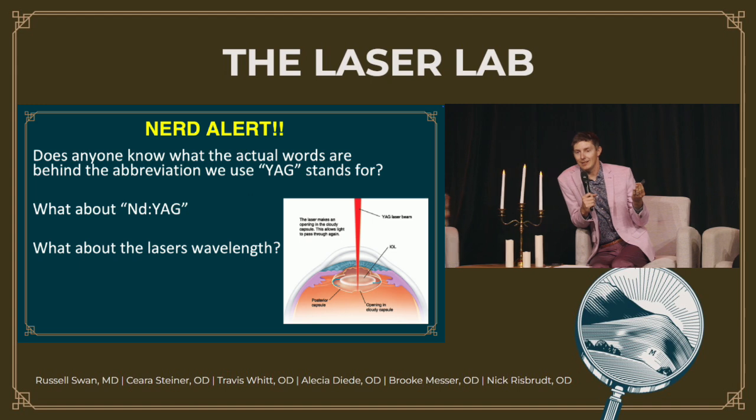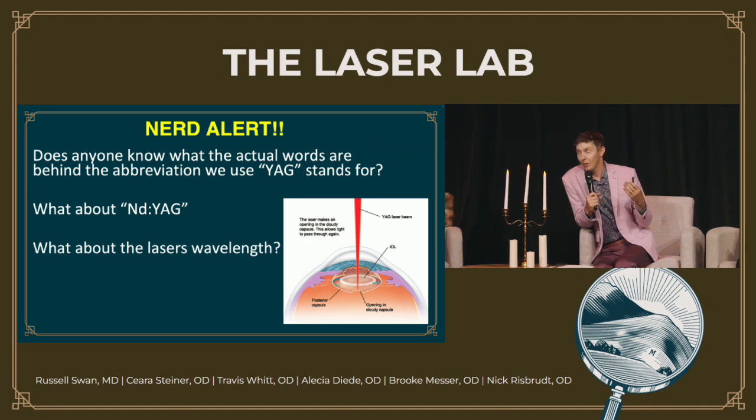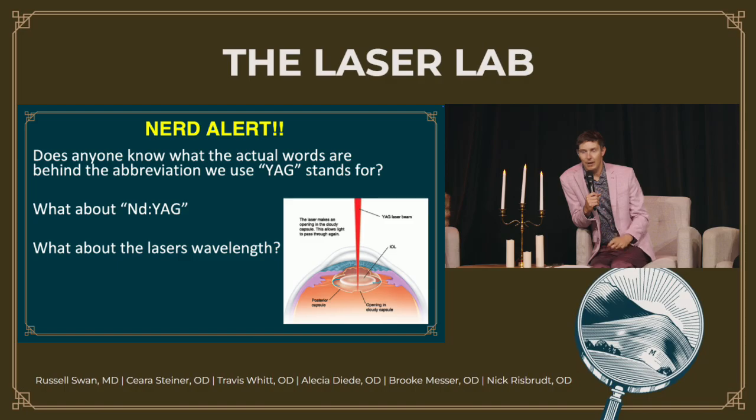The most embarrassing thing that I've ever done with a YAG, and you're going to be like, I can't believe you actually did this, but we had a patient with a 3-piece IOL. A 3-piece IOL is an indication that maybe there were some complications with their surgery, unless that's the common lens that somebody uses. But for a lot of surgeons, that's sort of a backup lens. And we had a patient who was like 20, 25, but had this central strand of capsule that went right through the center of their lens posteriorly and was really bothered by it. And I was like, well, vision's pretty good, but you have some glare. We'll just hit that with the laser, no problem. And YAG it, just actually only took one spot.